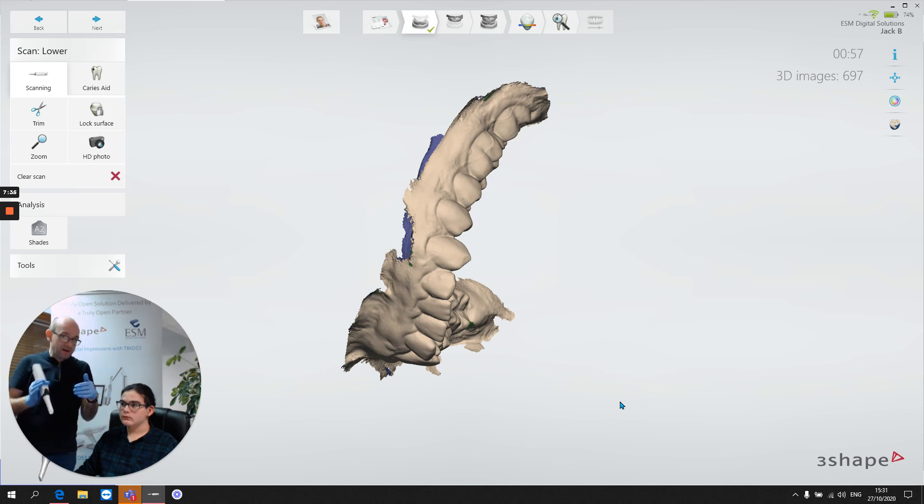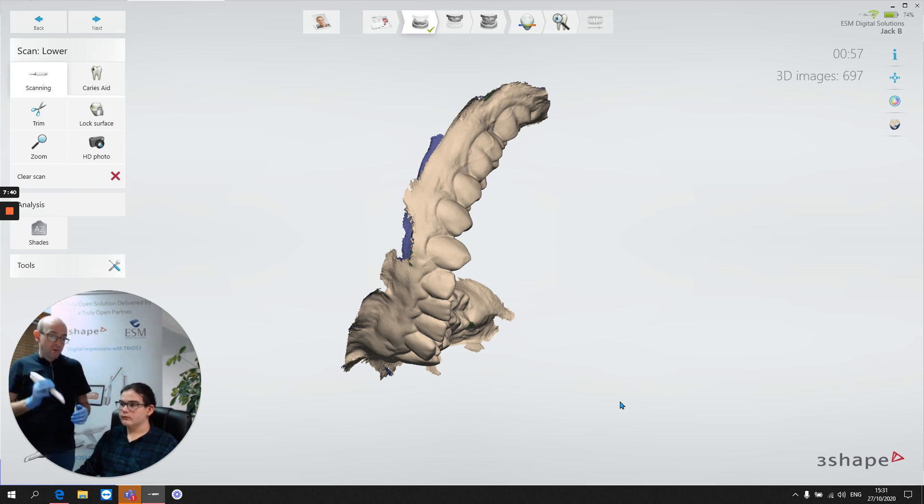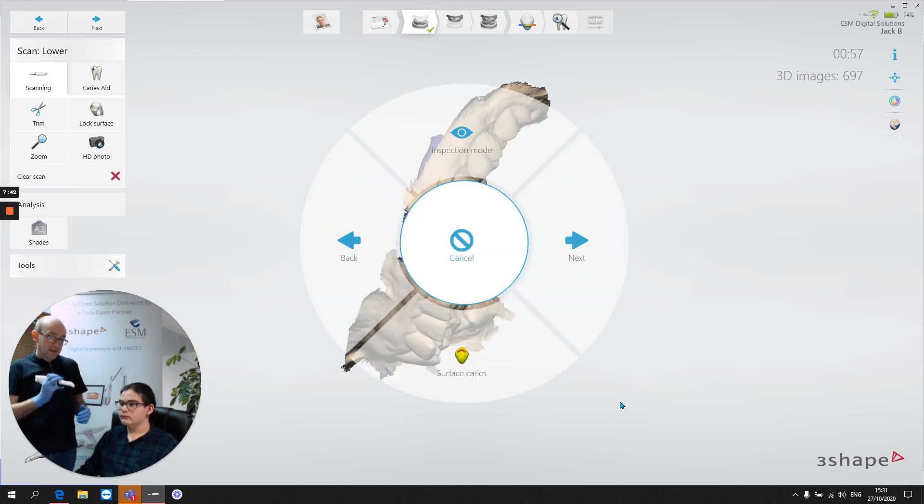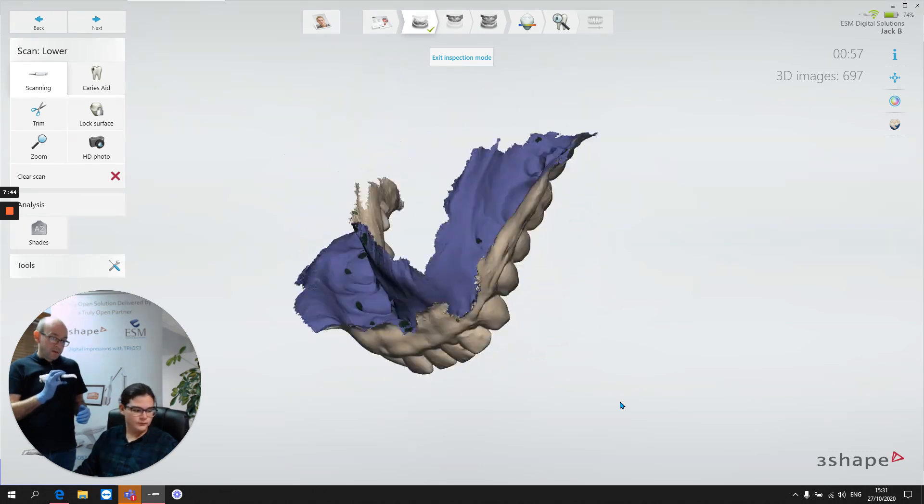Don't give that error a chance to start creeping in. Come to the midline. Come to the midline from the other side. And we end up with a really nice occlusal scan, like what we've got here.